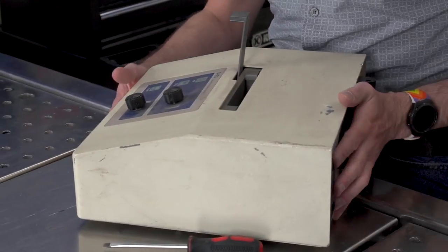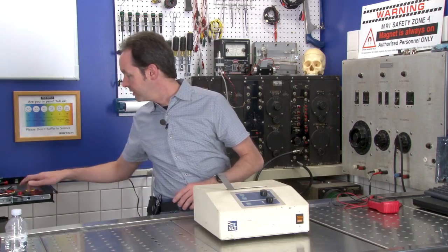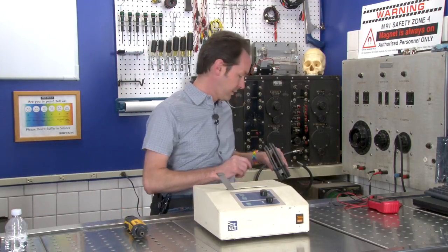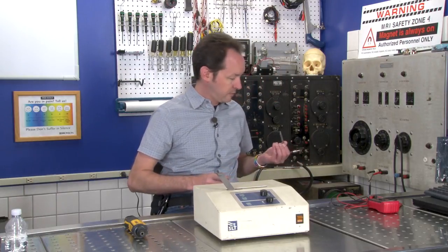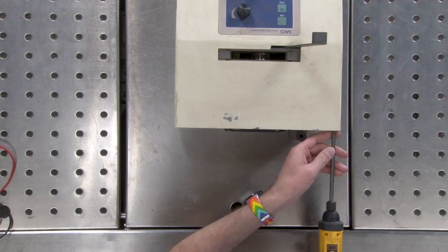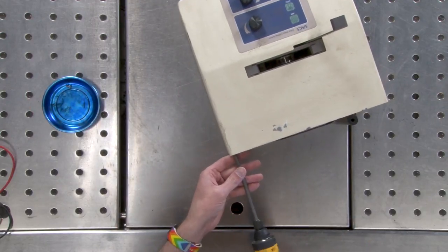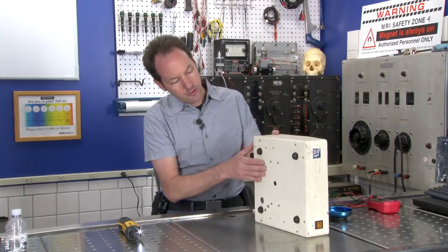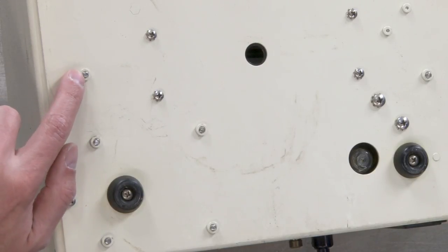Just because we don't have it working yet doesn't mean it won't be working by the time we're done. We're going to start by taking the back off. The back and the bottom are all one continuous piece. As you look at the bottom you'll see things where a piece of metal is welded to the bottom, and there's the end of a bolt — so you can tell something inside is bolted through.